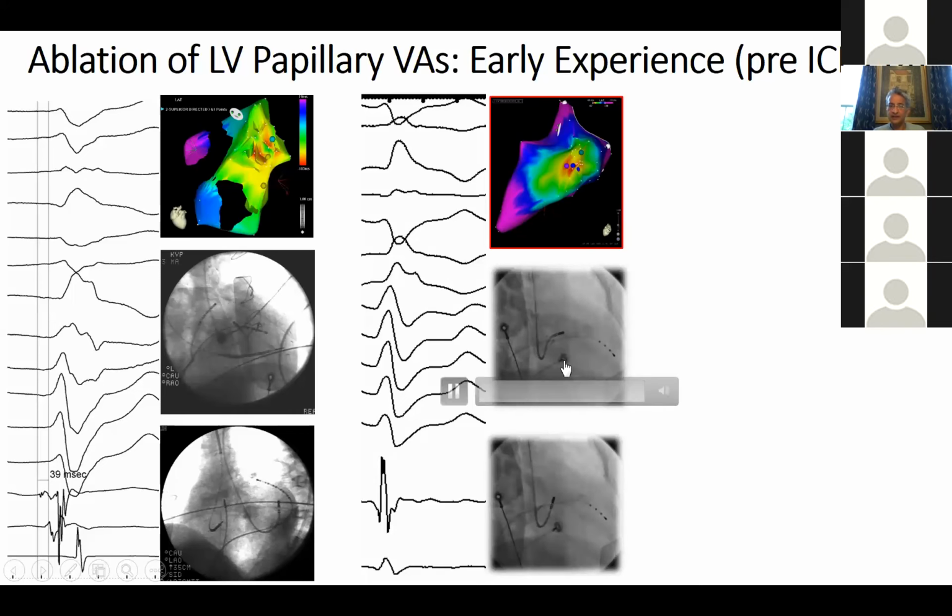But the interesting thing about this location was that when we had our catheter in that position, we could never get the tip of the catheter out to the silhouette of the heart on an LAO projection, which is what made us think that there is a structure that's prohibiting us from getting to the wall itself. And yes, obviously we all know about the papillary muscle, but we sort of stumbled upon the arrhythmia source.